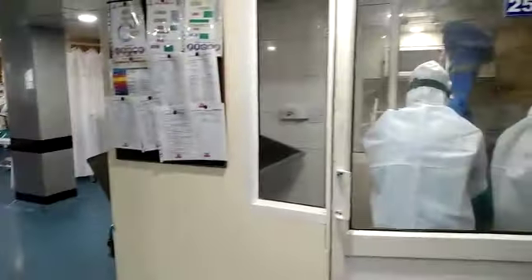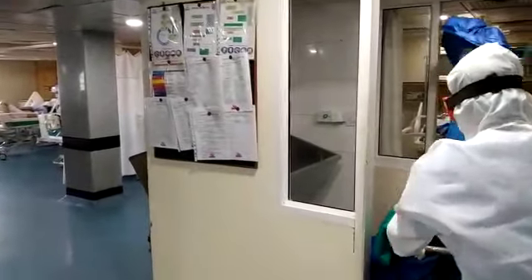Hello दोस्तों. So today I thought to take you on a tour inside COVID ICU of a tertiary care center hospital in Delhi.